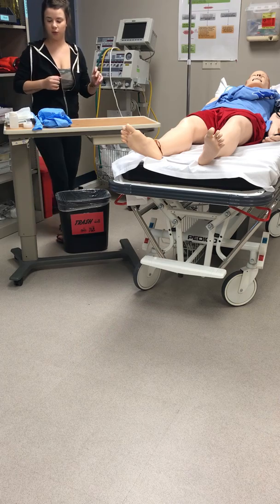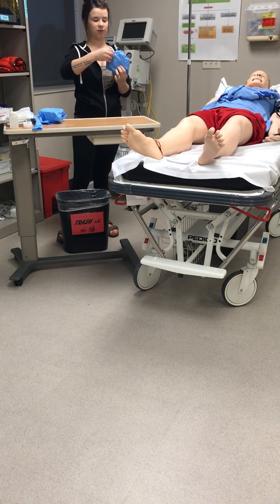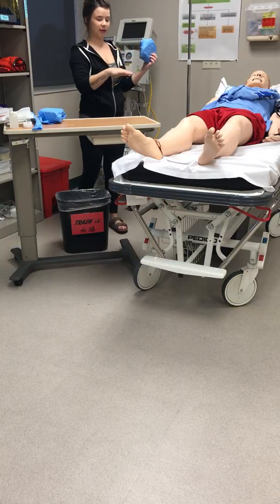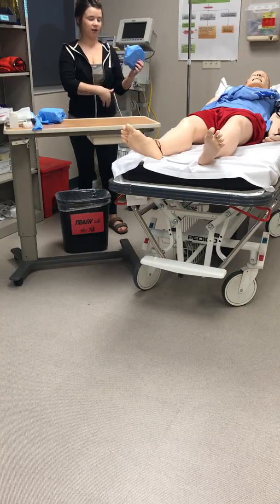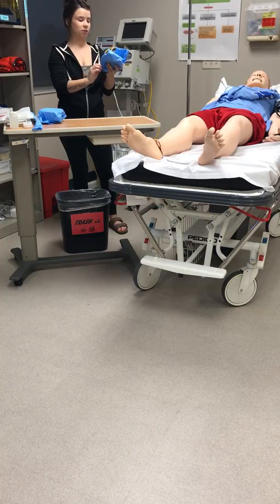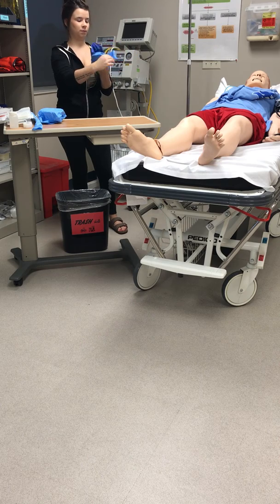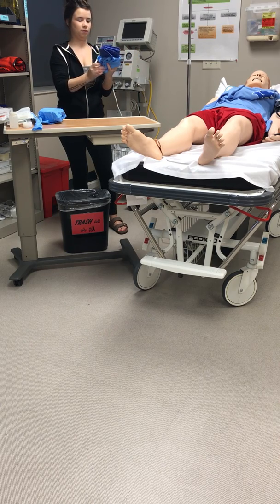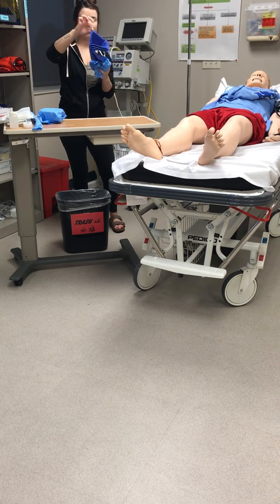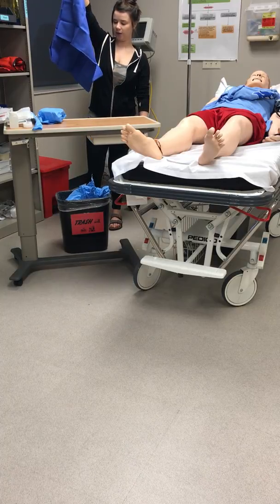Alright, so now I'm going to set up the sterile field. So I'm going to do the drape first. And I've got the bed and the table both at my waist height, so that I don't have to go below my waist. I'm just grabbing the 1-inch border here, not letting it go below my waist.